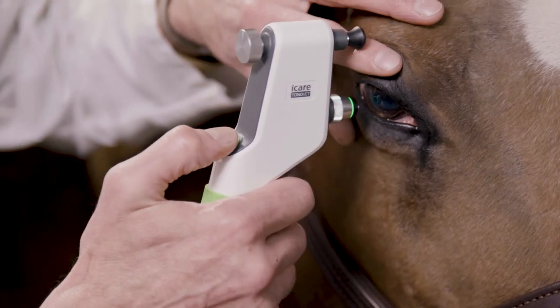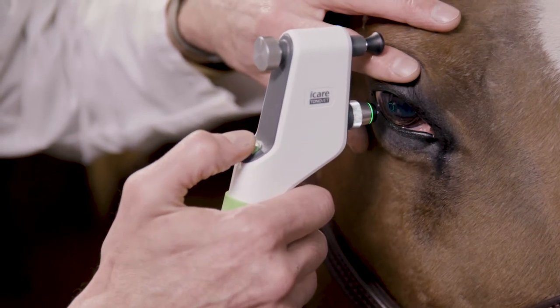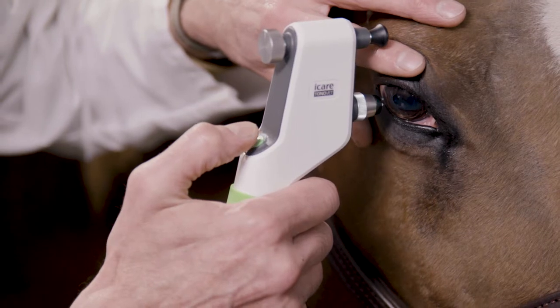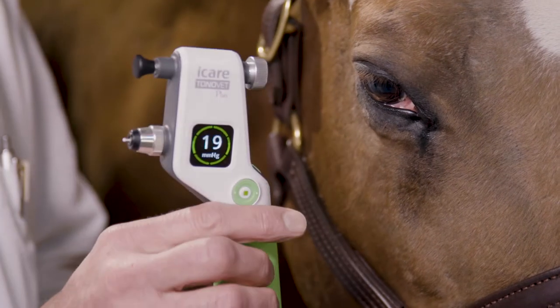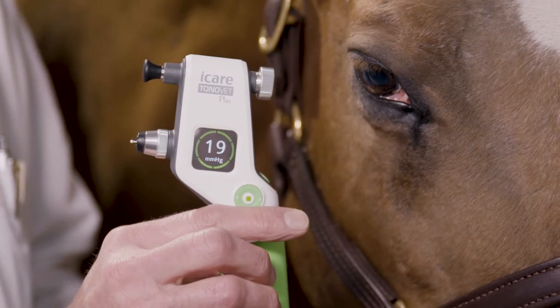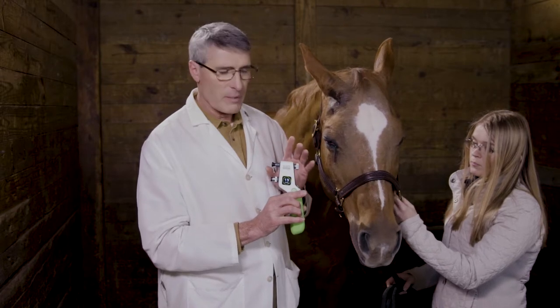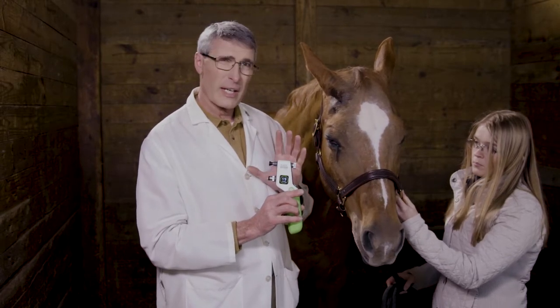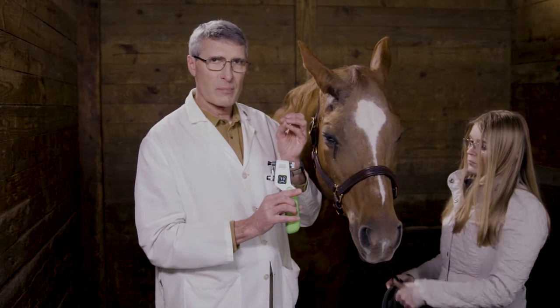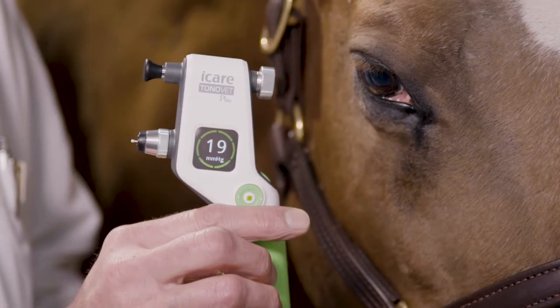I get my light to where it's green. The instrument has taken each reading — every time it got a reading, there was a beep signifying that it had taken a measurement. Usually it takes six readings and averages them, throwing out the high reading and the low reading, then averaging the rest. We have a pressure of 19 millimeters of mercury.